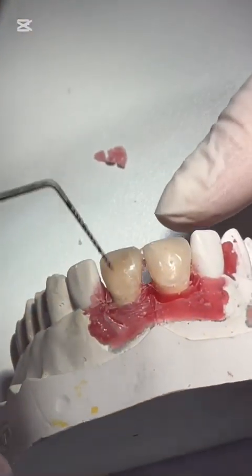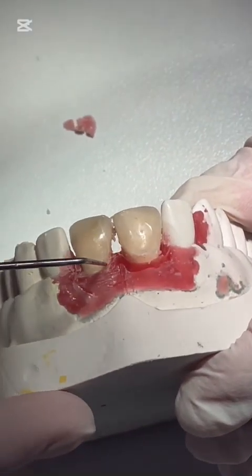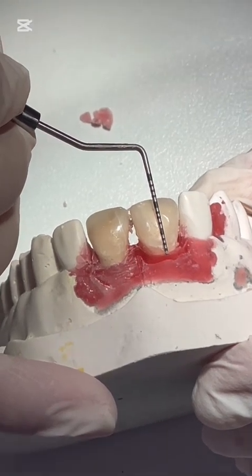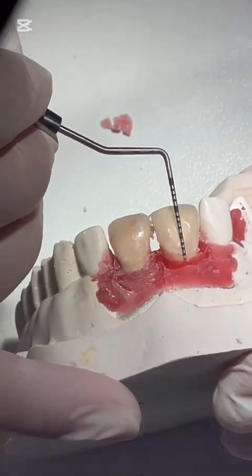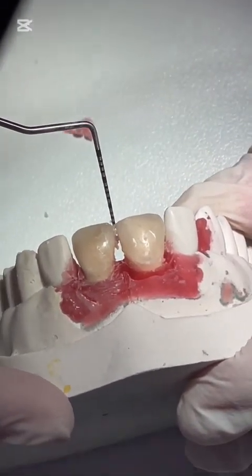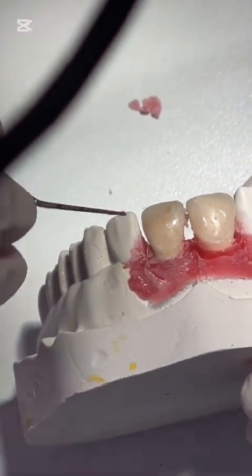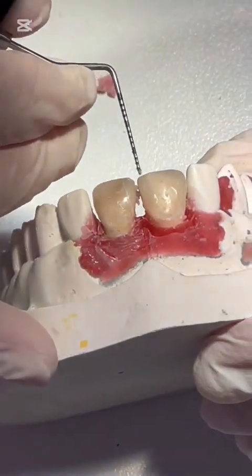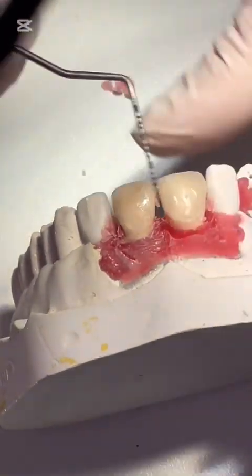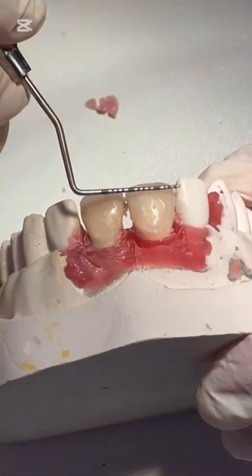In this case, let's say I'm happy with the gingival level and the biological width is not allowing me to make any kind of gingivectomy or crown lengthening, and the bite is accepting the elongation of the central incisors, so I will increase the length of the centrals. So this will be 13.75 with the width of 11.